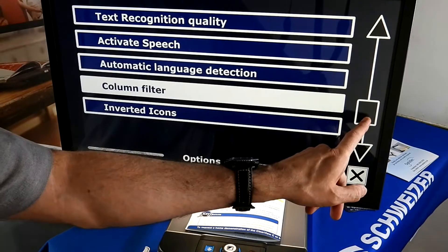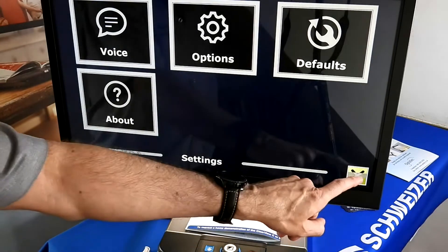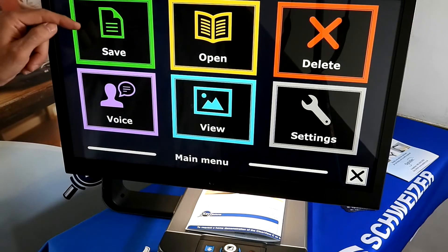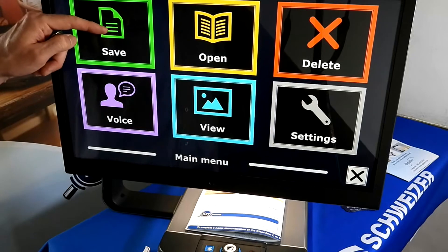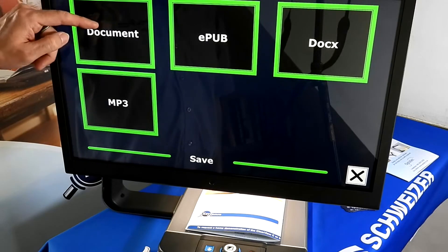There is quite a range of settings, and you can default everything back to factory default if need be. For documents, if you wish to save a document, simply click on Save. In the Save As menu, click on Document — that is the one you use for most operations.